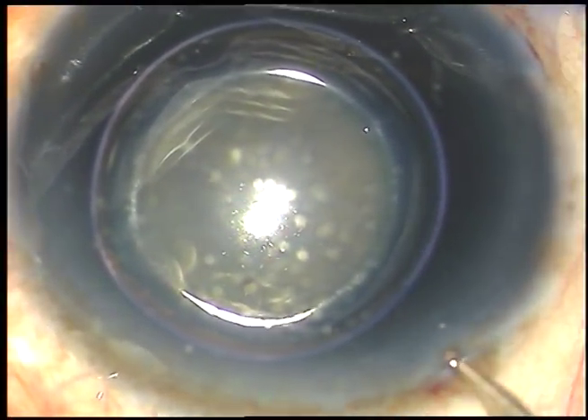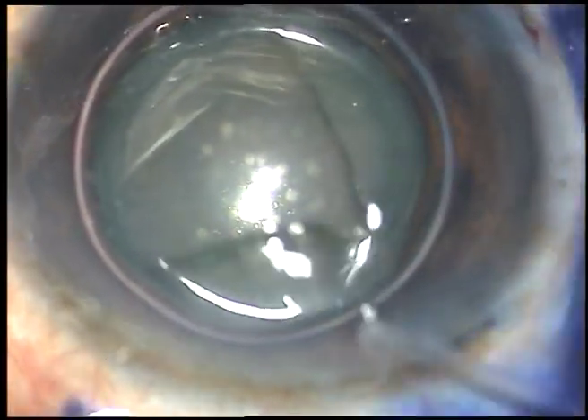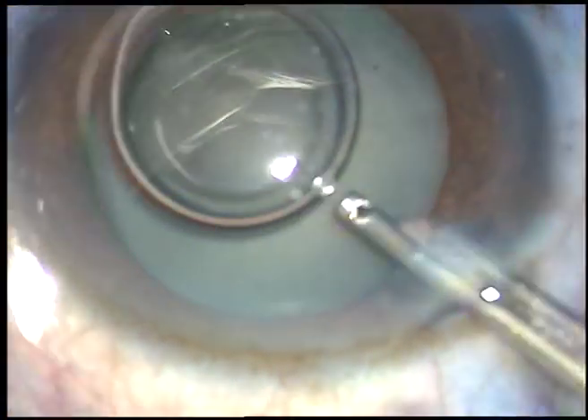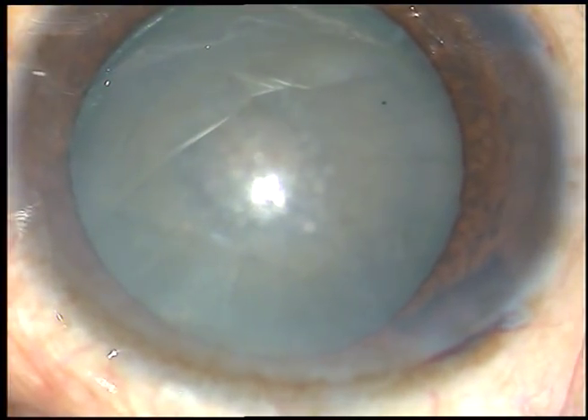A little bit of adrenaline has been injected in this case to see if the pupil dilates a little more. Now the dye is washed out. After administering adrenaline, the pupil has dilated a little more.